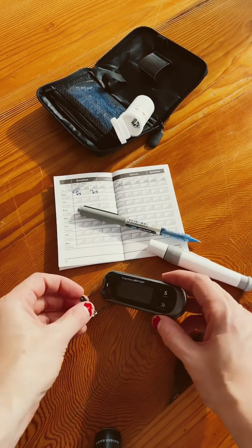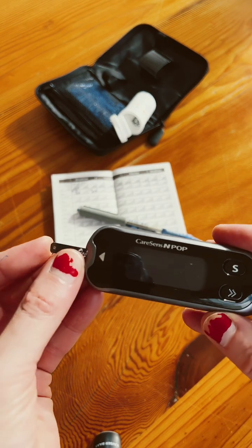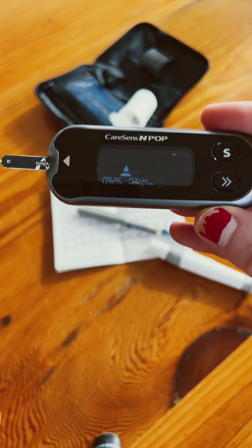To test your blood sugar levels with the CareSense device, you first get one of these little strips and you pop it into the end here until you see the little blood symbol.